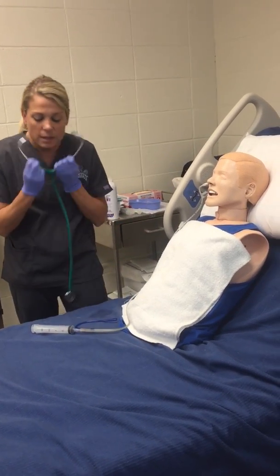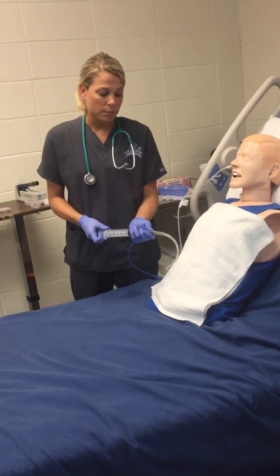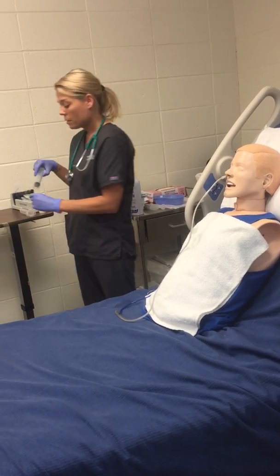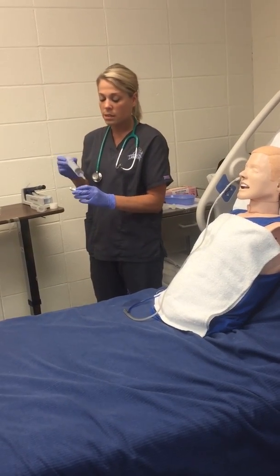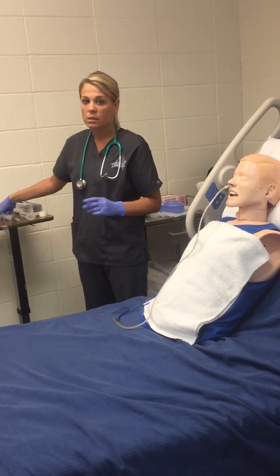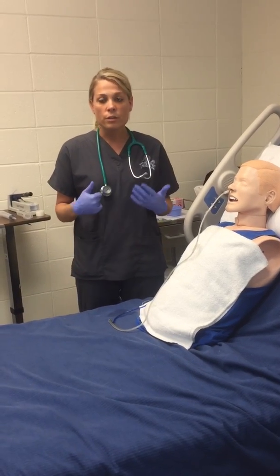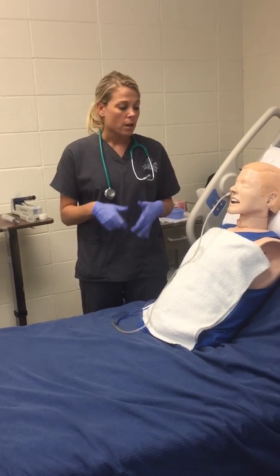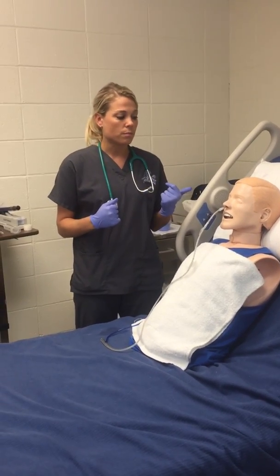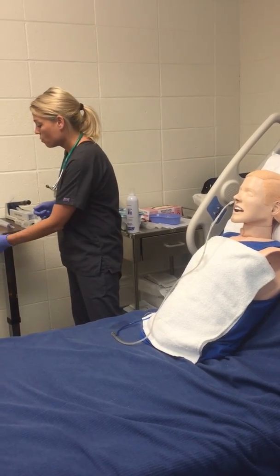Another way you can do it is by pulling up some gastric acid and then putting the acid or the contents on the pH paper, making sure it is the same pH level as what the stomach is. And then the definite way you can tell that you're in the correct place is by x-ray. So for this, we are in the right place, so we're going to secure the tube more by placing some more tape on it.